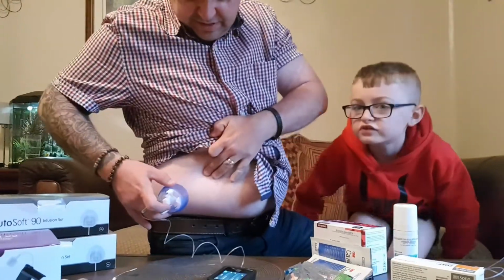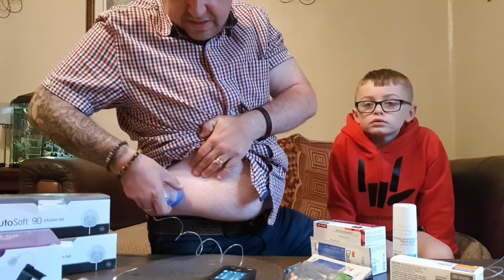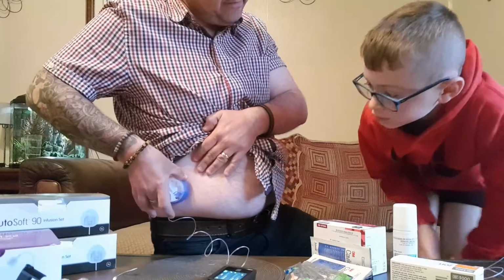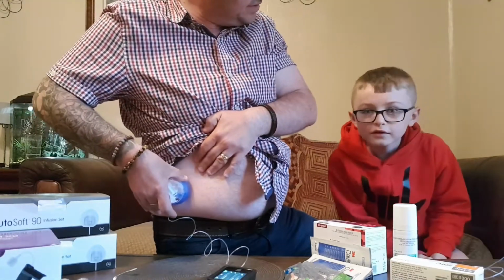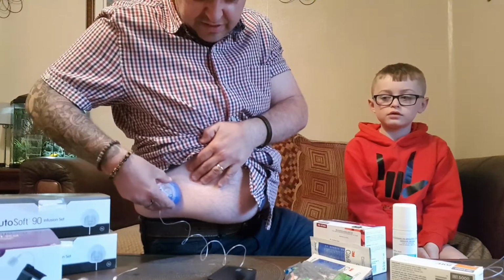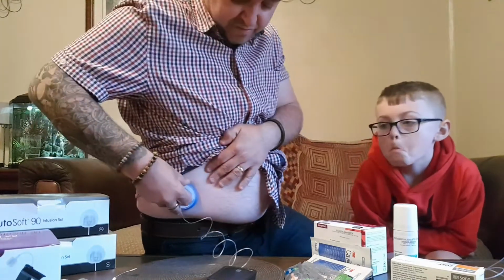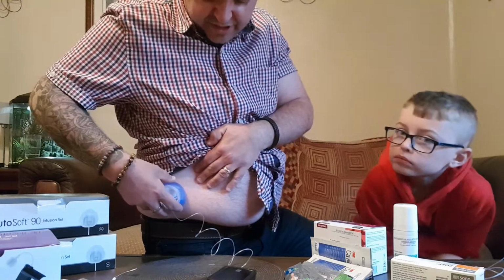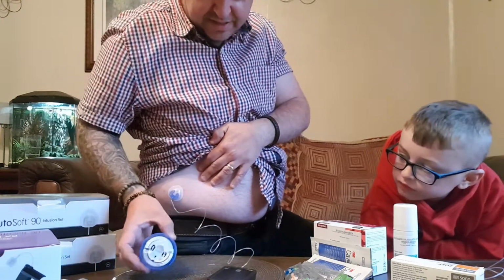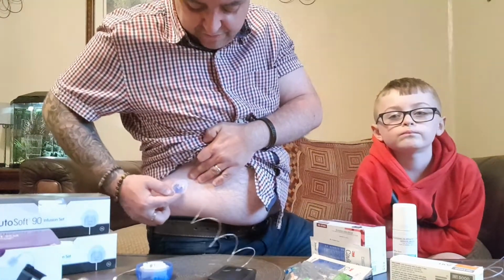So that's going to go there. I want the tubing there. Right, do we count to 3? Yes. So 1, 2, 3. That's gone in. Now we don't press on that. Some people do and press quite hard, but I don't. Just leave it for a few seconds, and then you just pop the plaster off to stick. There we go, it's on. Done. So we rub around there to make sure it's on.